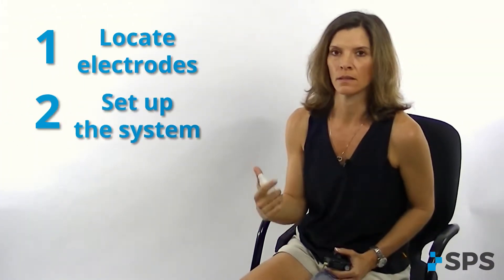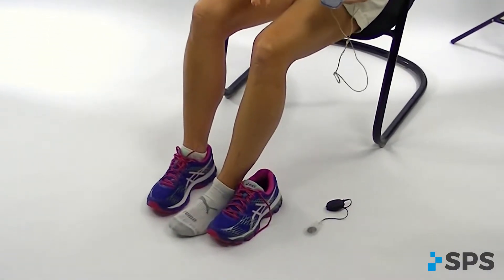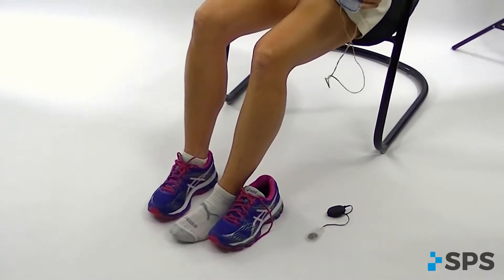The three steps are: locate electrodes, set up the system, and walk and tune. The first thing you want to do is have your patient seated in a stable chair, with knees slightly flexed, foot not planted on the floor so that you can see the foot moving when you position the electrodes and get everything in the right place. Please refer to the drop foot electrode placement video or handouts to see all of the different electrode placement options.